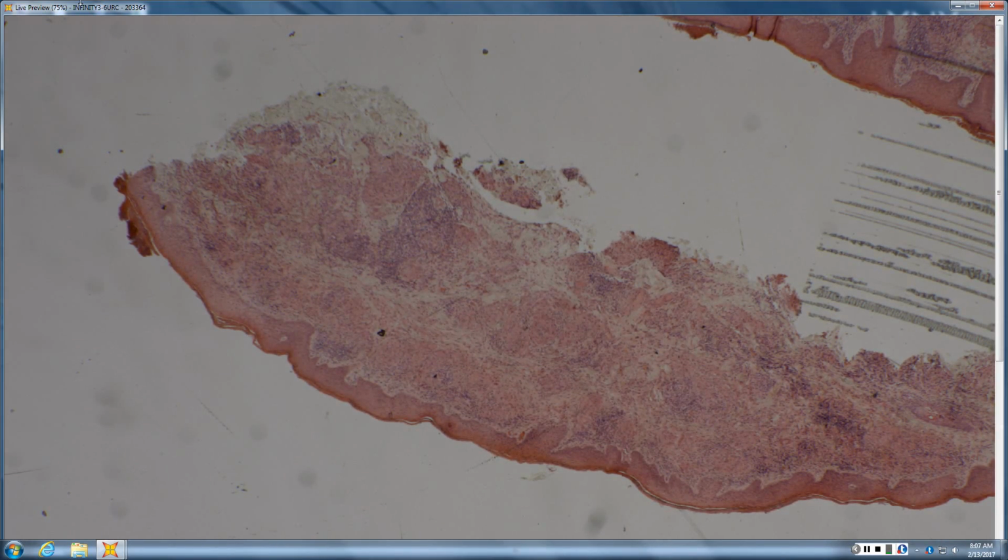All right, so in the dermis, very busy. Looks like a granulomatous infiltrate. So are these granulomas naked or dressed or partially clothed? Partially clothed? Yeah, these are kind of partially clothed. They can't decide, right? So a lot of them have no lymphs, which would be naked granulomas, and then some have lymphs, which would be the opposite of a naked granuloma. So for the ones that are naked granuloma, what's your differential? So yeah, the main thing I think about is sarcoid. Sarcoid, but sarcoid's not on my pick list. So what else looks like sarcoid?